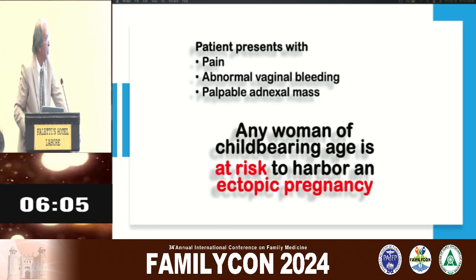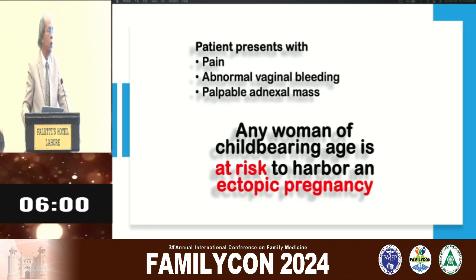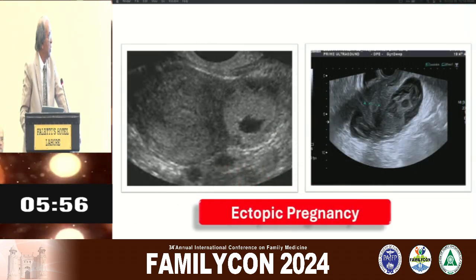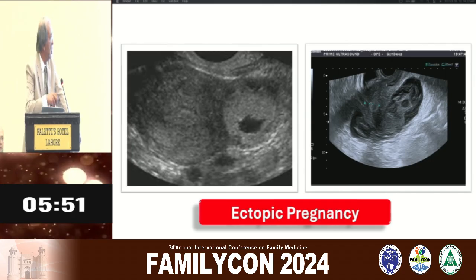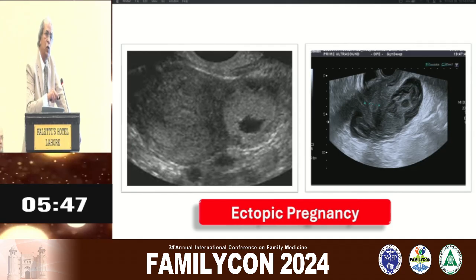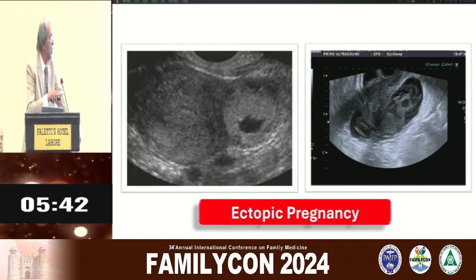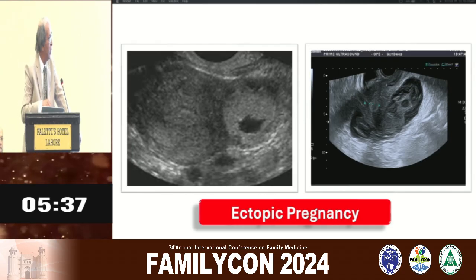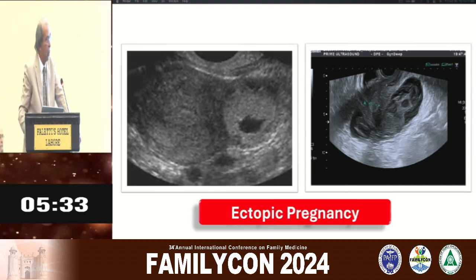With patients with these complaints, we should always remember the risk of ectopic pregnancy. That can be anywhere, as Dr. Manzoor Sahab has told. This is a tubal pregnancy. This is the tubal ring. It is as echogenic as it is in the uterus for an intrauterine pregnancy. And this ring usually should be more than 2 to 3 millimeters. And that is a ruptured tubal ectopic. You see fluid around, the uterus is empty, the endometrium is thickened.